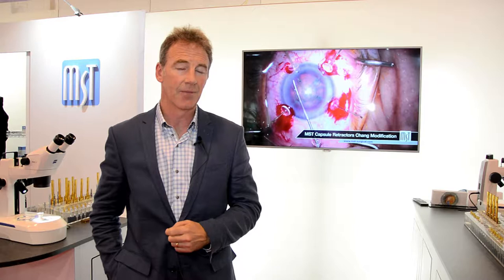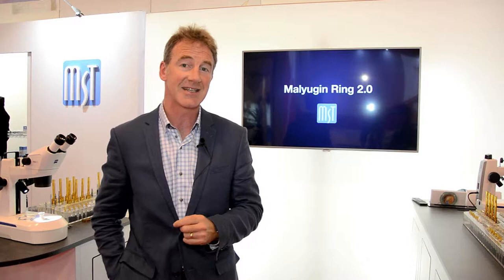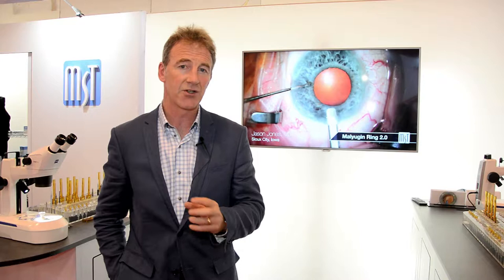I run a training program which has 30 trainees and we spend a lot of time using the STEMI microscopes that I was first introduced to by the MST team to teach advanced cataract surgical techniques, in particular the use of the malugan ring and the MST capsule retractors.